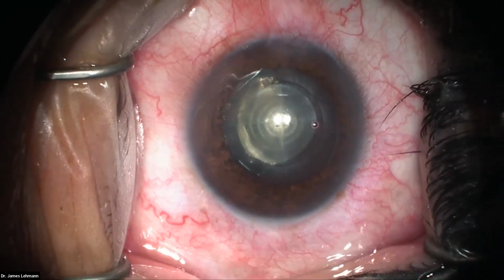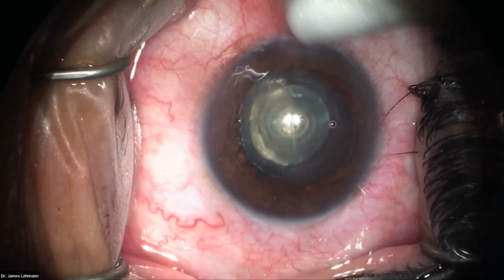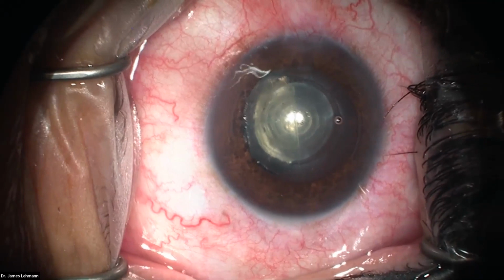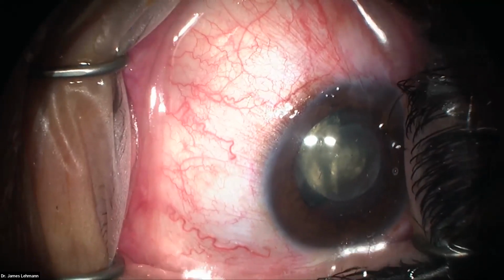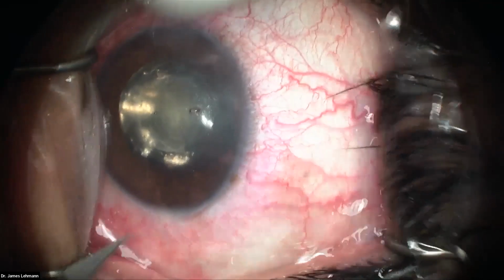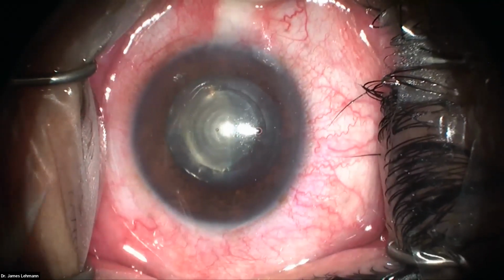So this patient, like I was saying, is monocular, and he was very nearsighted, and we chose to leave him slightly nearsighted still because he is going to be monocular. We want him to wear protective eyewear. So we're going to leave him around a -2. That's the idea. And this is done under topical anesthesia. So mire para abajo, señor, un poquito. All right. So I'm just fixating the eye with a Q-tip.